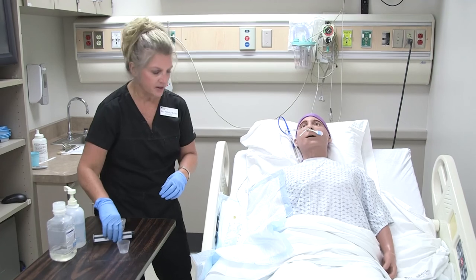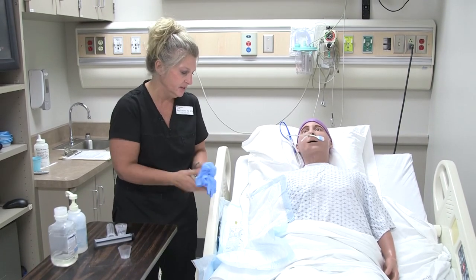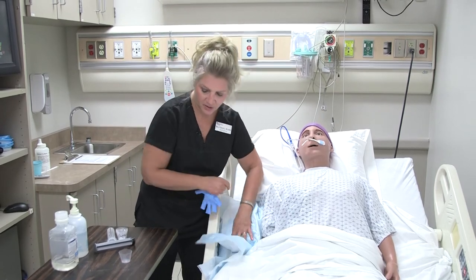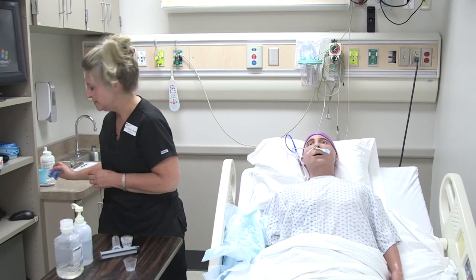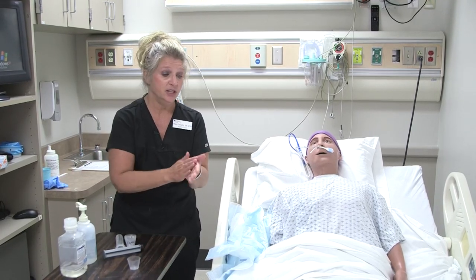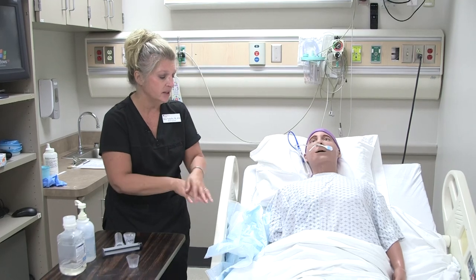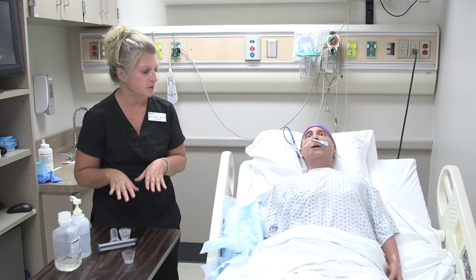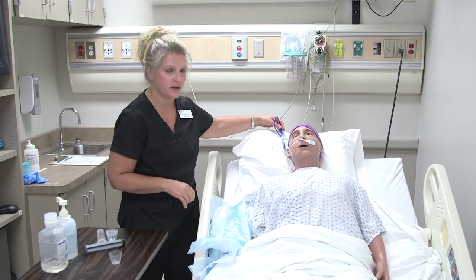That completes our medication administration through the enteral feeding tube — the NG tube. We're going to wash our hands and make sure the patient has all the safety checks in place: bed is locked and low, call light is present and accessible, table is at the patient's bedside, and all alarms are set as necessary on the bed.